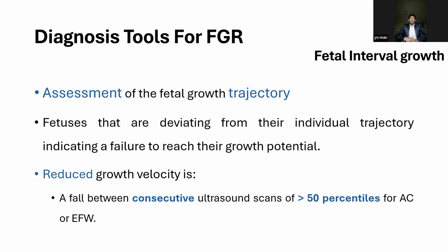So, diagnostic tools for fetal growth restriction. The first one is fetal interval growth, what we call fetal growth velocity. It's a trajectory, so fetuses that are deviating from their individual trajectory indicate a failure to reach their growth potential.